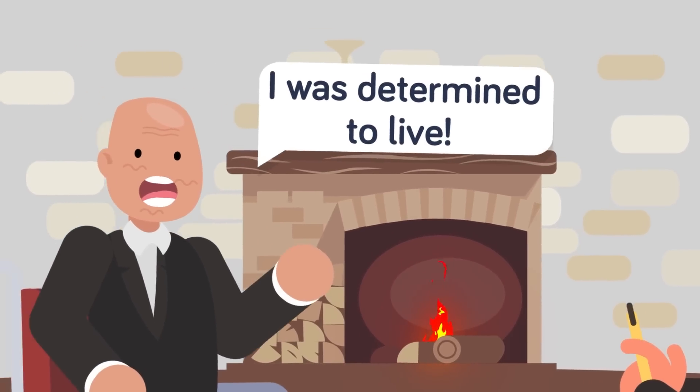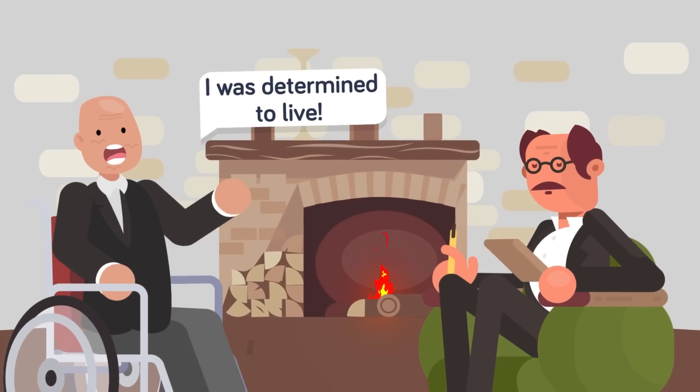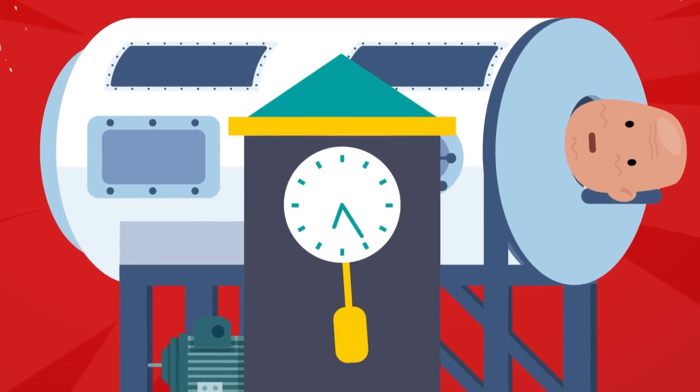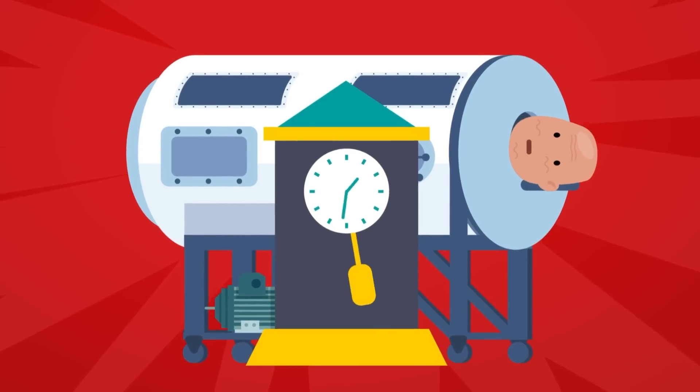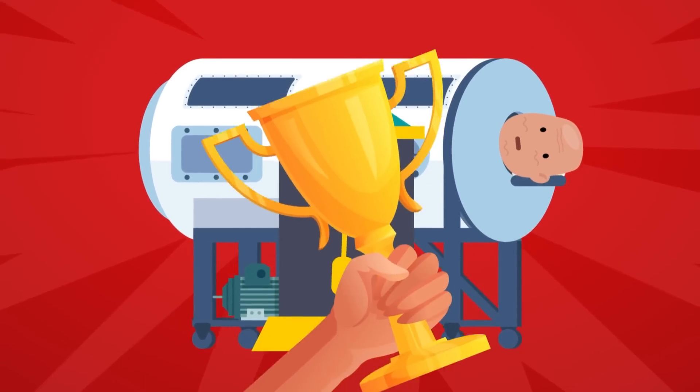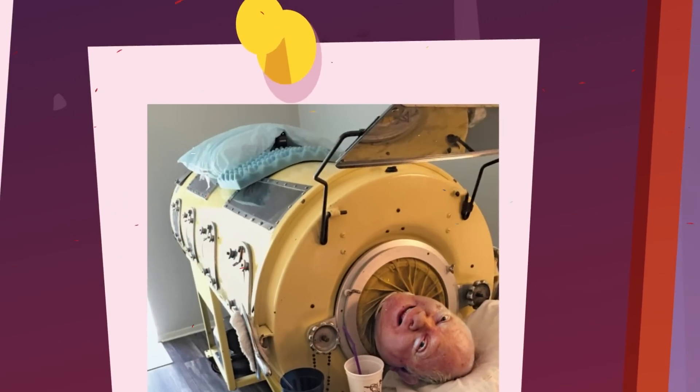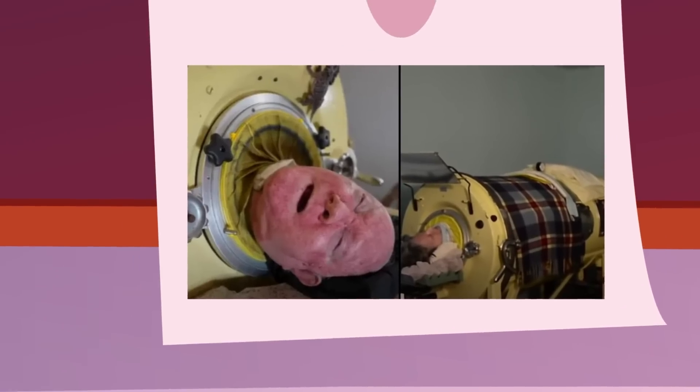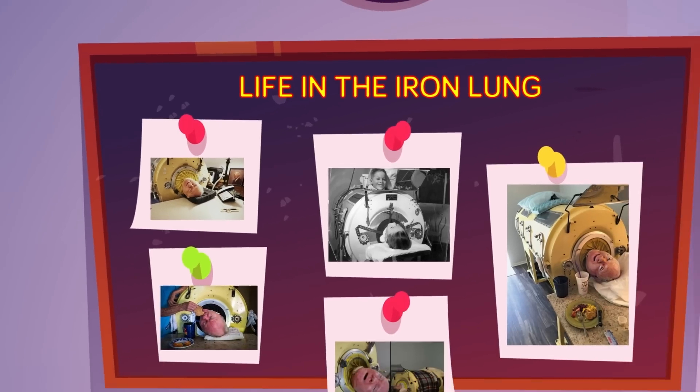Over time, he was gradually able to leave his iron lung for extended periods of time, and Paul would go on to live to this day at the ripe old age of 77. He also holds a Guinness World Record for being the person who spent the longest amount of time living in an iron lung, as well as being the only person alive today to live inside an iron lung, as Paul still needs to be placed inside to aid his breathing. While not typical of all polio patients, or even all of those who were treated via the use of an iron lung, Paul Alexander's story does provide us with one of the best, most detailed descriptions of what it was like to live inside an iron lung.